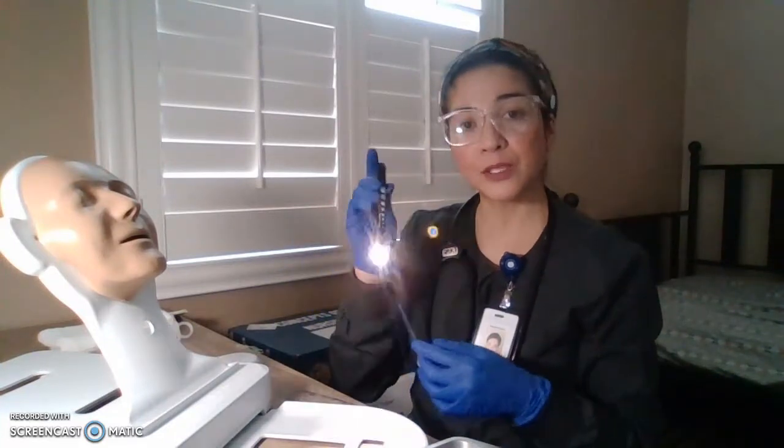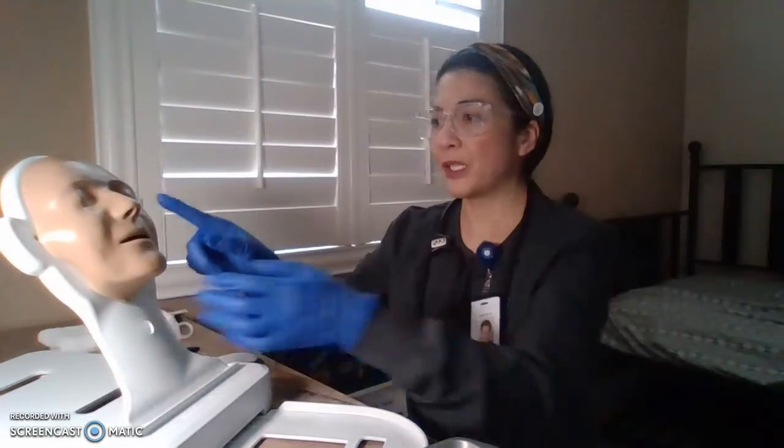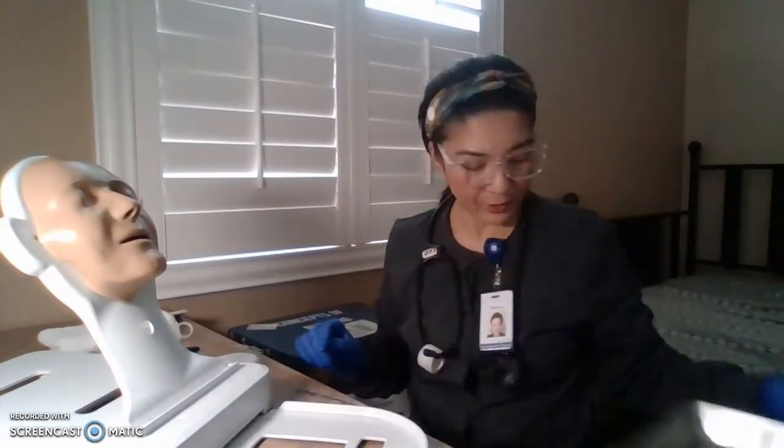Two ways. One is you use your pen light to visually inspect. Okay, no deviation, no obstruction. And then next is to have the patient exhale on one nostril and exhale on the other. Thank you. So for this one, I'll be using the right nostril, okay? There's no deviation or no obstruction over there. So now what are we going to do next?